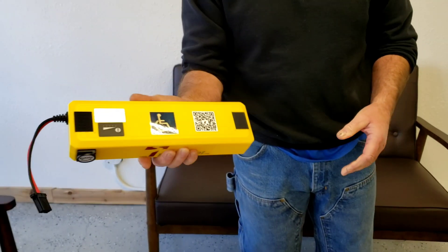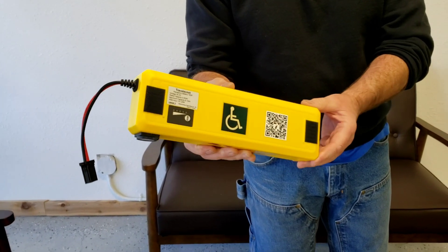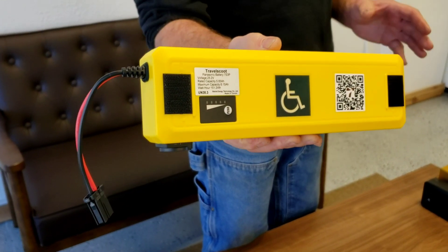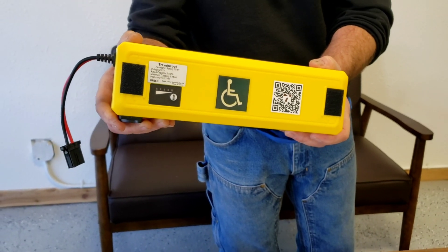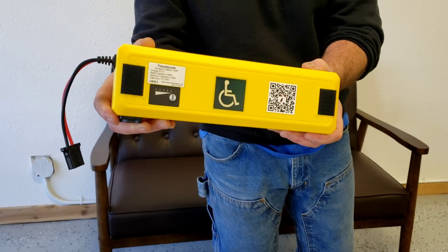It's a very handy size. It is primarily for folks that are traveling with airlines or in countries that have a stricter than standard limit on the watt-hour capacity rating for lithium-ion batteries.